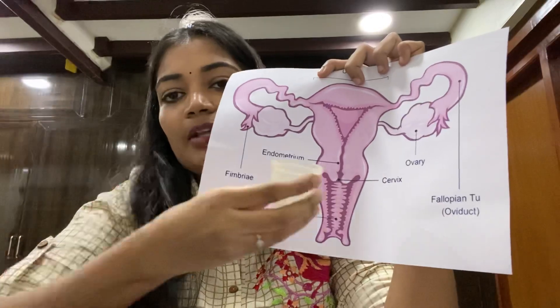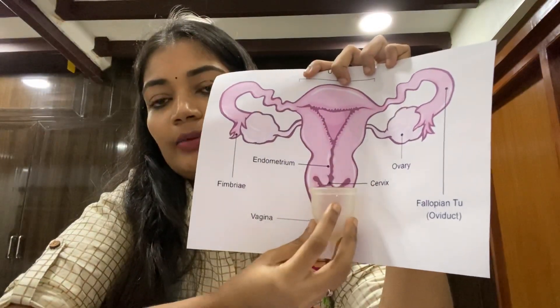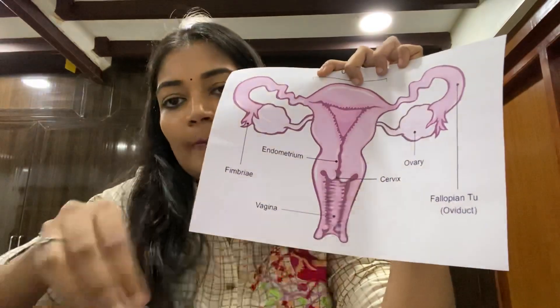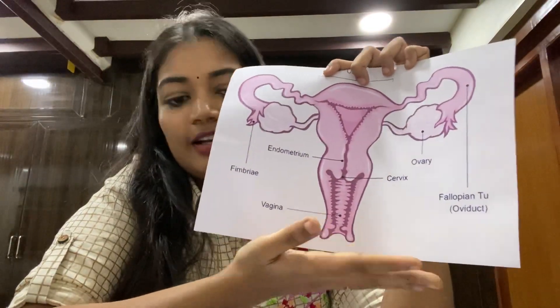Our cup is placed in the vaginal canal. When you place it there, you can collect the blood in the cup. Here is a clear explanation of that.